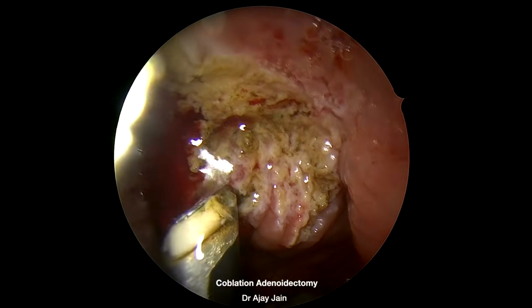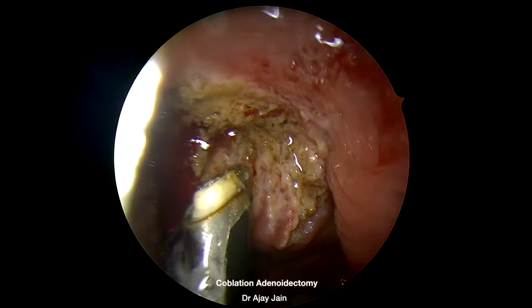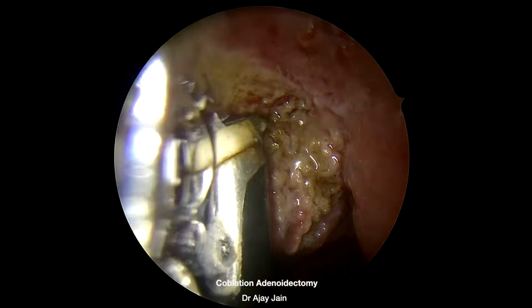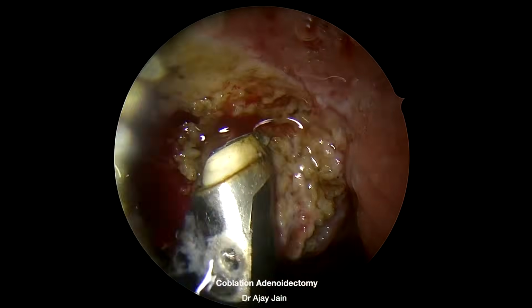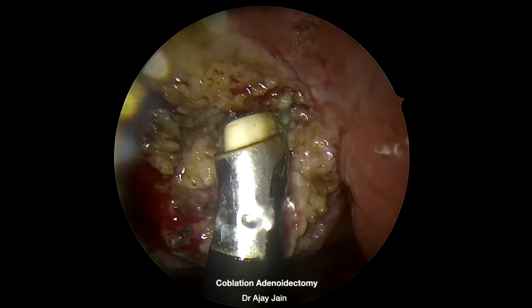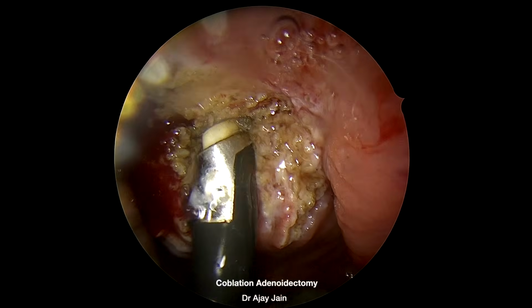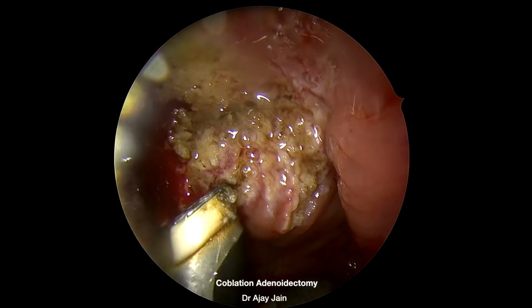Not much bleeding now. Towards the end, only minor residual flakes of adenoid tissue remain.